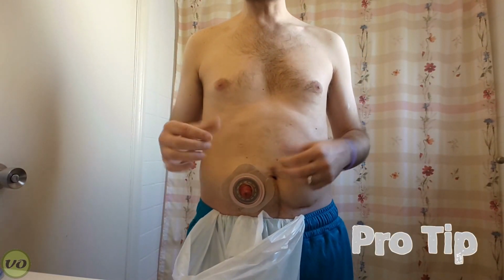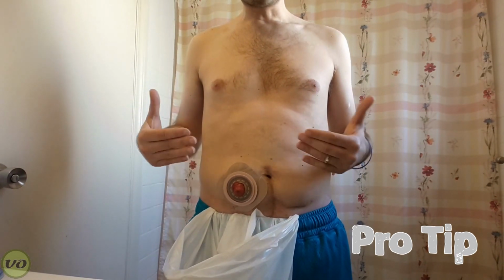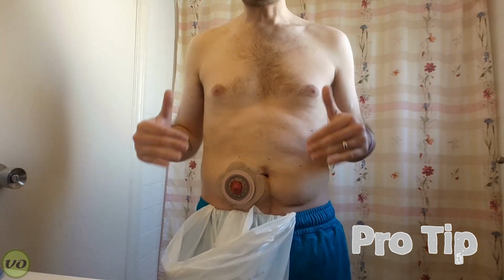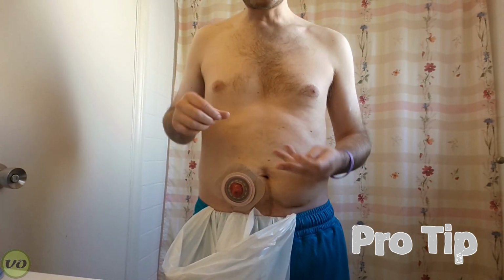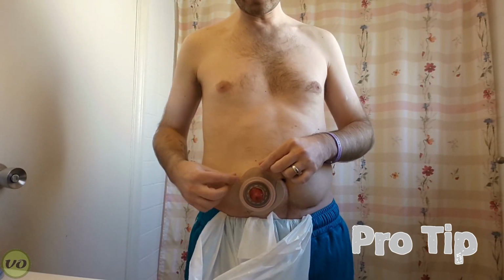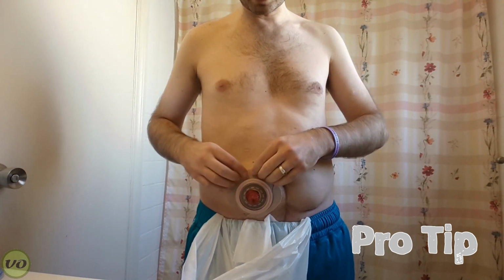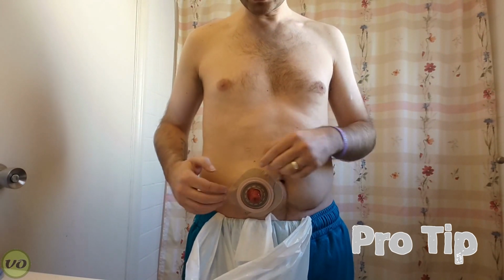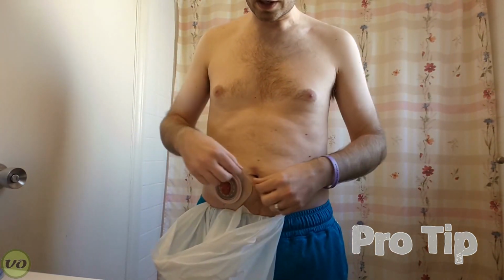And you want to be careful how you put the wafers on. I tend to be standing up. If you're sitting down, what happens is when you stand up, the skin will stretch a bit, and sometimes you'll get a bit of irritation. So even when I'm putting down these tape borders, I try not to pull it too much because then it will start to cause a lot of tearing on the skin if you're moving around a lot.